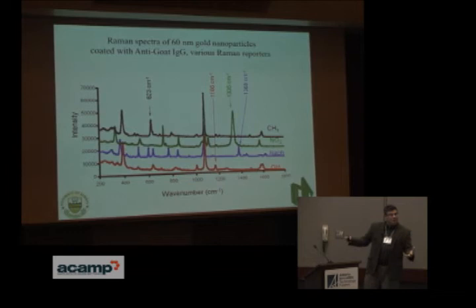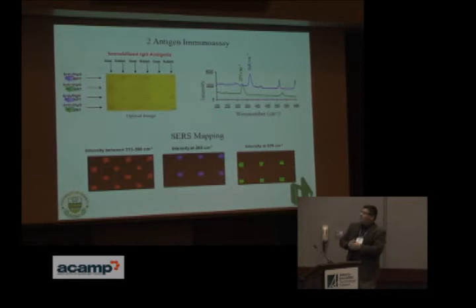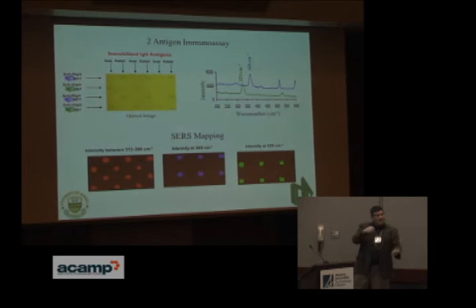multiple detections. Okay, and just an example of that, it's not very multiple, it goes from one to two, but this is our two antigen immunoassay, and so we have two different antibodies on the surface. We expose that to two different antigens. They're captured by the appropriate antibody, and then we expose the whole chip to a mixture of these nanoparticles. One set of nanoparticles contains a specific antibody and its own label. Another set of nanoparticles contains a different antibody and a different label, and they go where they're supposed to based on the specific interactions of the antibodies and the antigens.